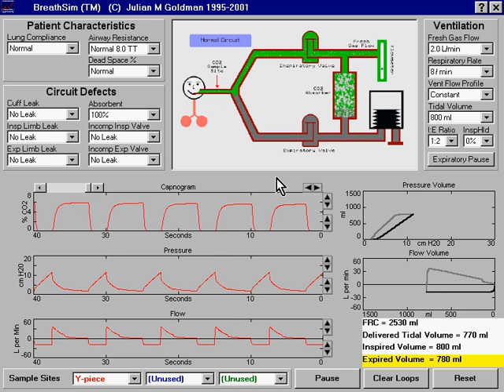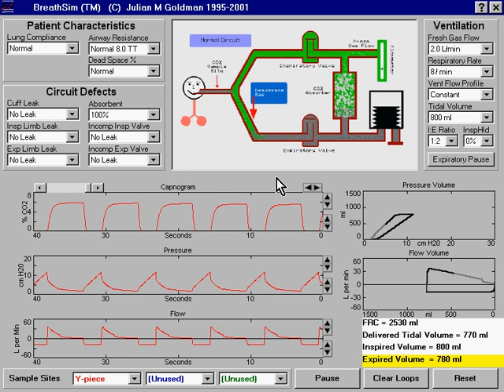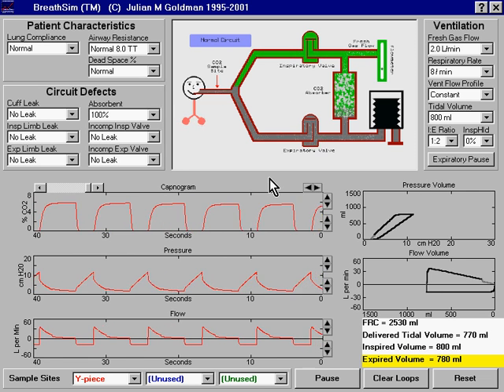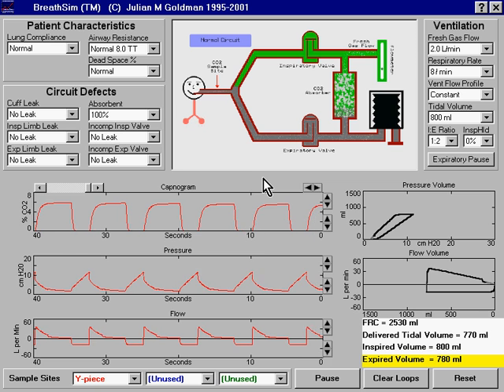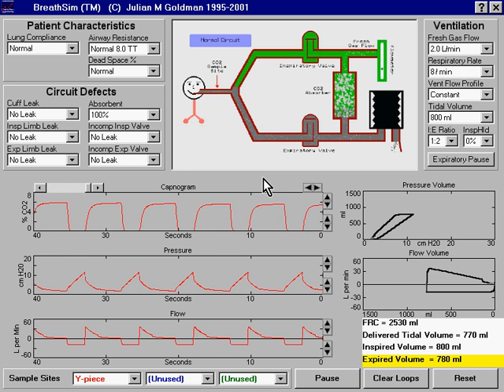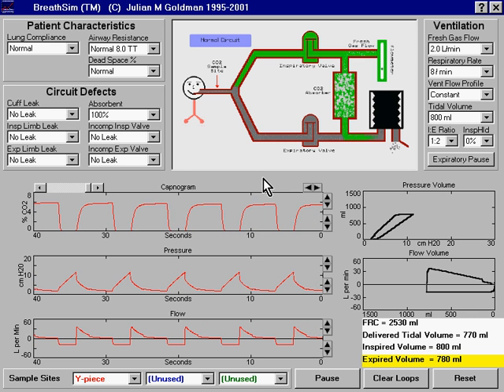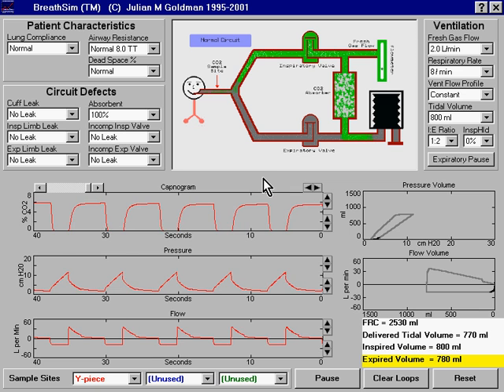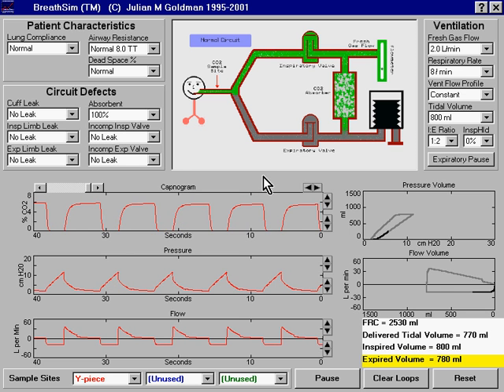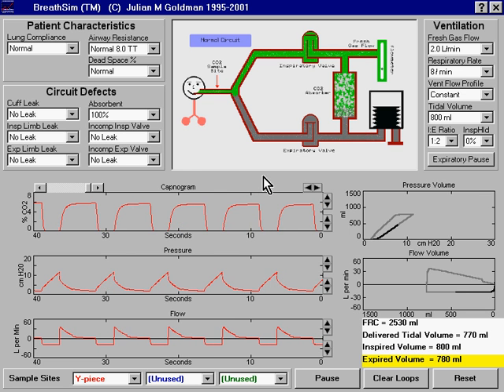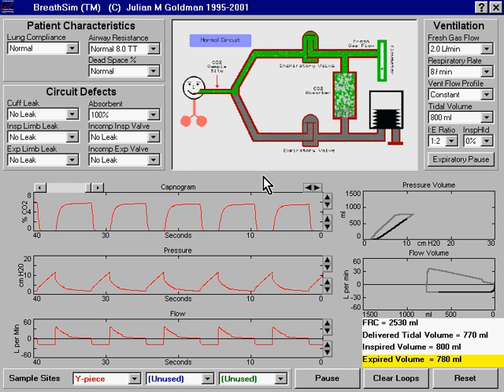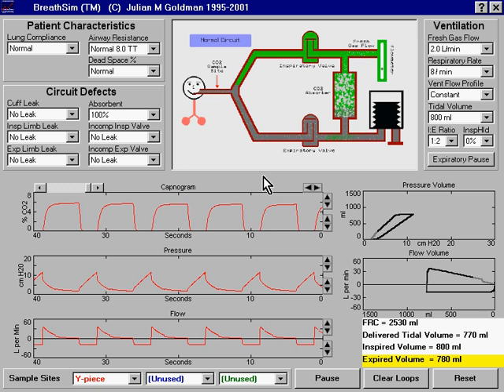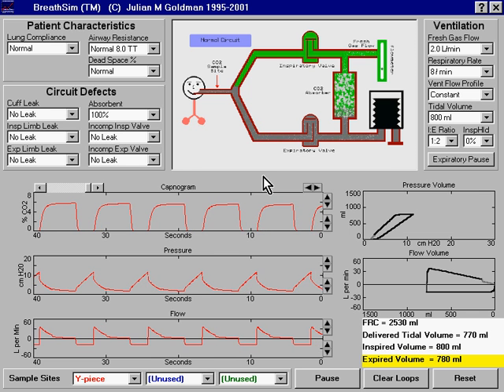Let's take a look at the gas flow pattern and capnogram morphology that results from an incompetent inspiratory valve. But before we do that, let's look at the factors that are responsible for generation of a normal capnogram and the normal flow pathway in the inspiratory limb.